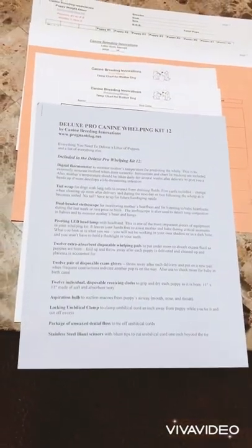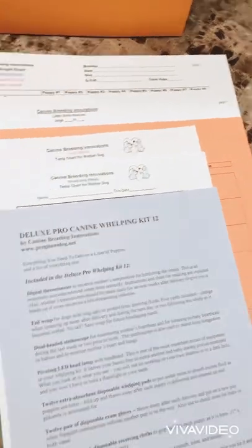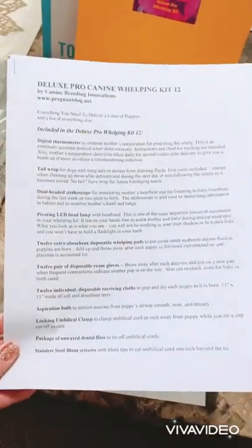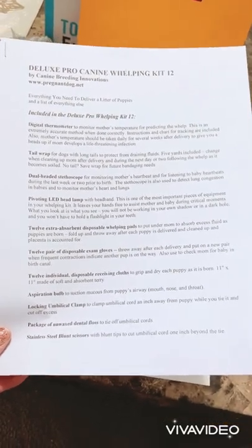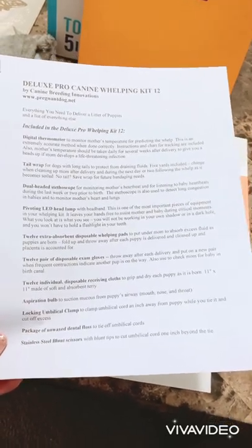I'll start off with the paperwork that was included in the folder. Most of it's pretty self-explanatory, but I'll just give you a brief overview. The very first thing here is just a list of contents of everything that should be in the box, so you just want to look it over really quick and make sure you're not missing anything from your kit.